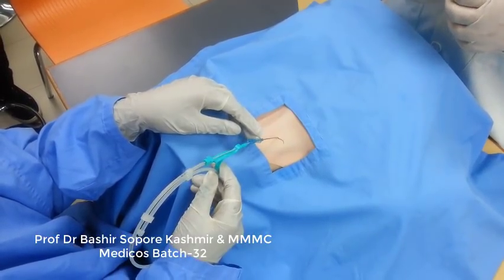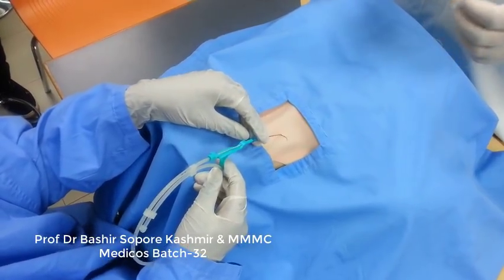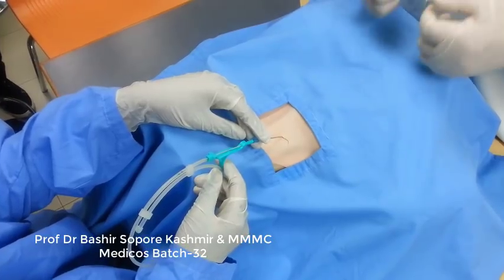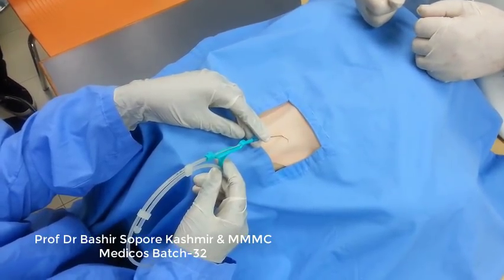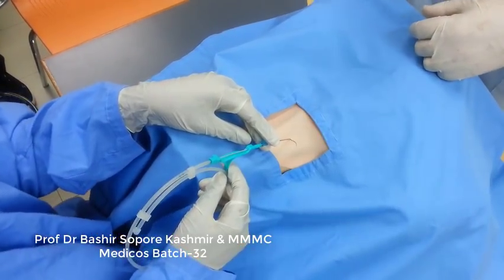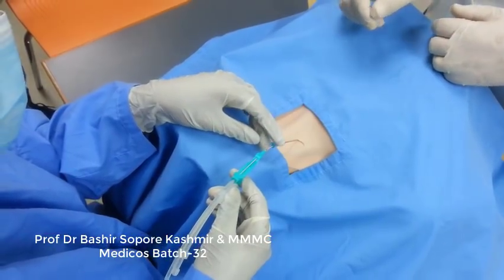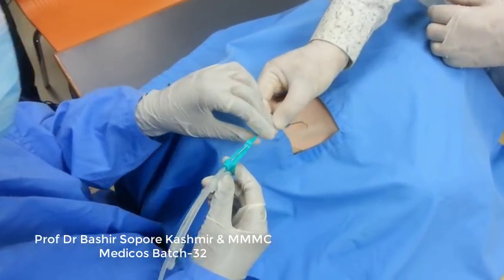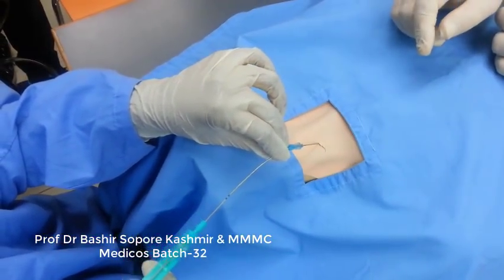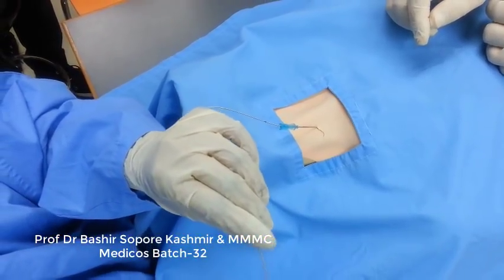But some of the books write 15 centimeters. I have told you the disadvantages of going too far, so you have to be very careful. That is why after the catheterization we take an X-ray, and we find out whether the catheter has gone too far. So now you have to keep holding it, because if you don't hold it, it is going to slip. Yes, take it out.